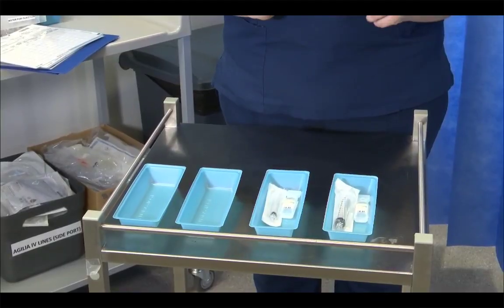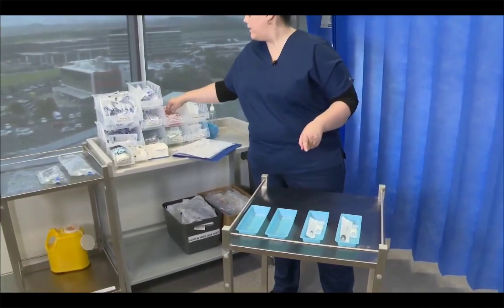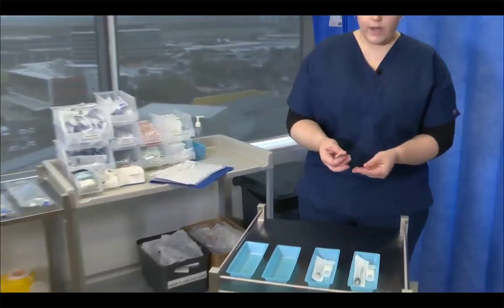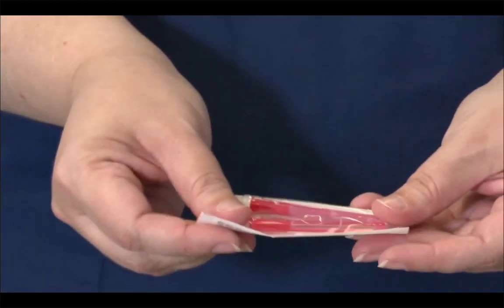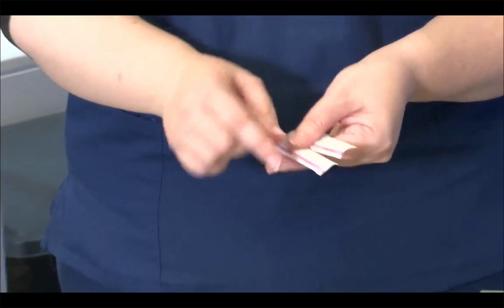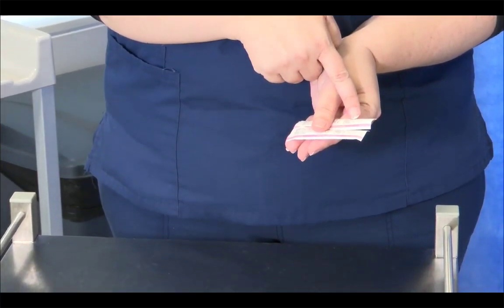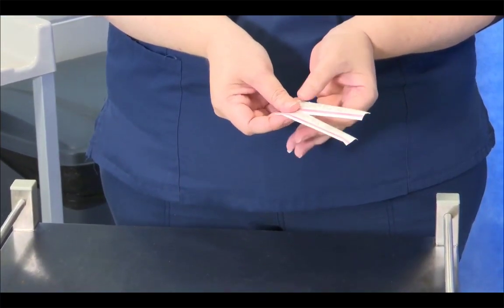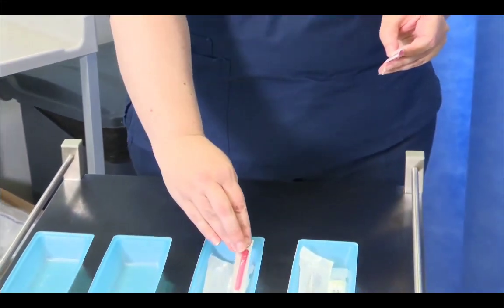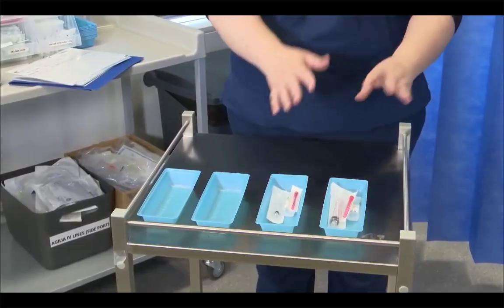Both of these are drawn up using a red needle, so I require 2 red needles for this. So red needles are beveled, but they are not sharp, so we use these just for drawing up. So I'm going to check the expiry date on each of these, which is 2027 and 2027. I have 2 of them, and 1 is going to go in each of my 2 trays. And that's the first part done.